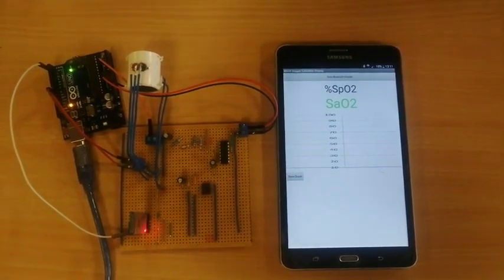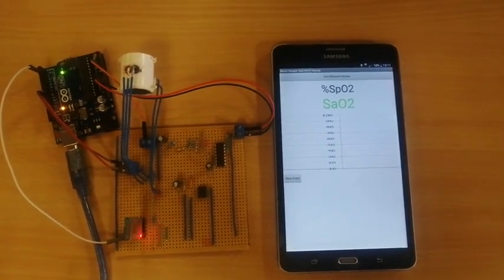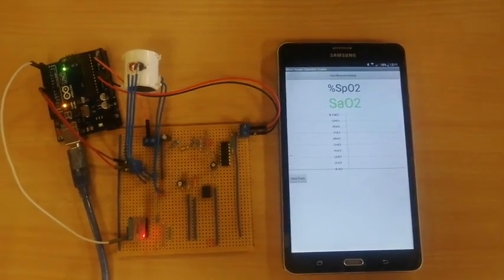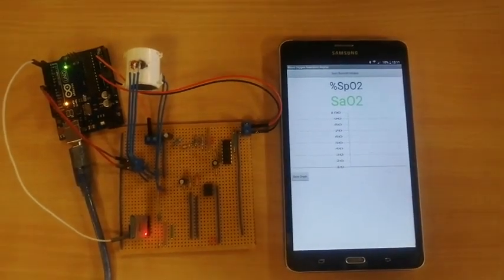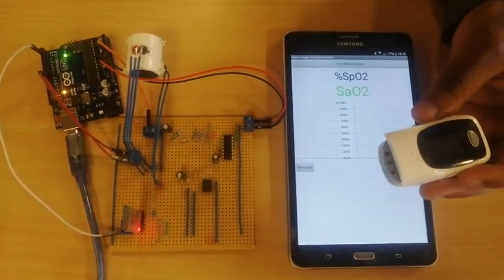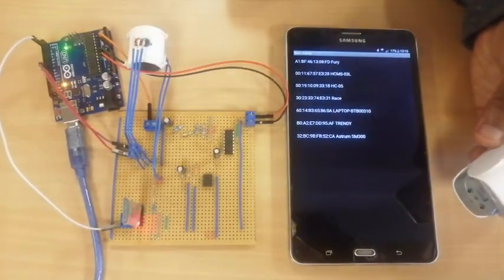8005. The blood oxygen saturation display application is created using an online free open source software called MIT App Inventor, used to create mobile applications for Android. To demonstrate the functionality of the circuit, we will use the commercial pulse oximeter. So the first part is to connect to the Bluetooth module.